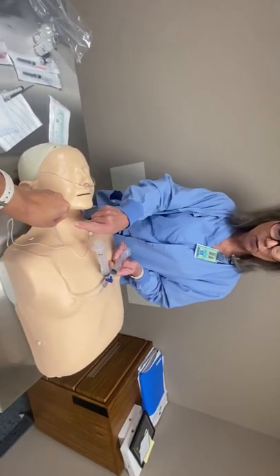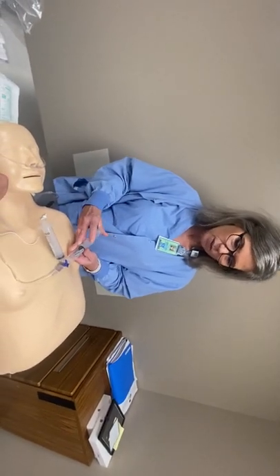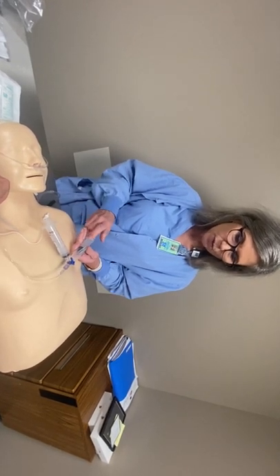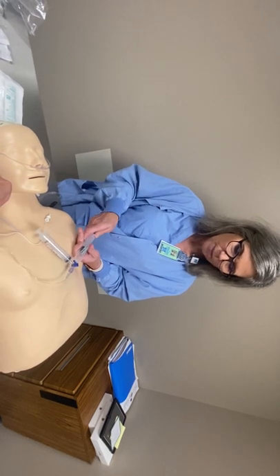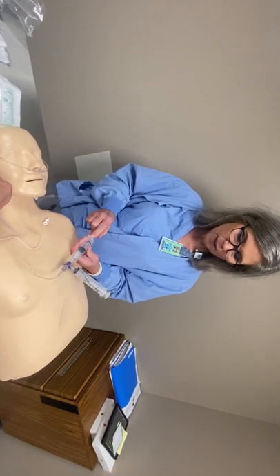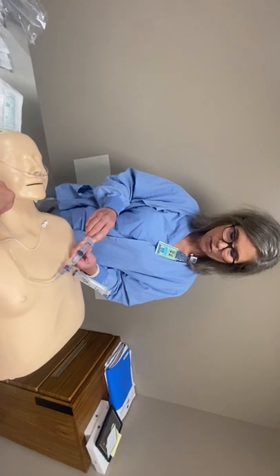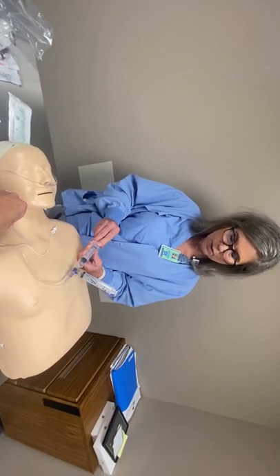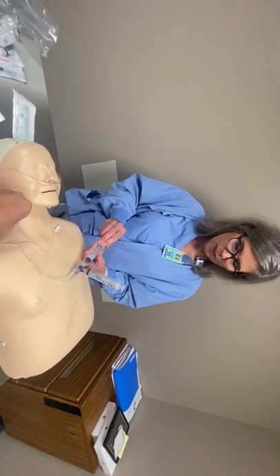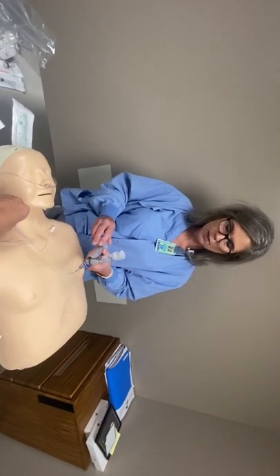To inject, you first pull back and always watch the hub for blood — you never want to see blood. If it's negative, say 'negative,' and then they'll say 'inject.' Inject three to five cc's very slowly. You shouldn't meet any resistance; if you do, let them know, and if they say continue then keep going. Let them know where you're at on the syringe — for example, 'I've given five, pulling back, giving another five — doctor, I've given 10 mils total.' Go very slowly. If you ever see blood or meet resistance, stop immediately and tell your anesthesiologist.